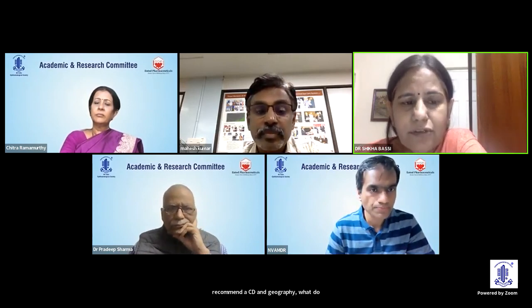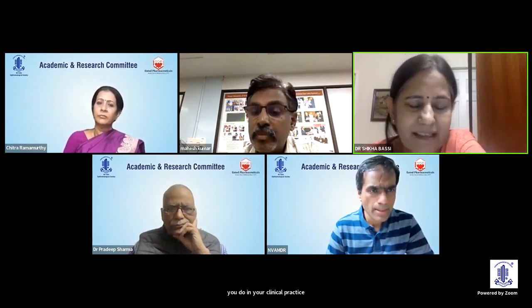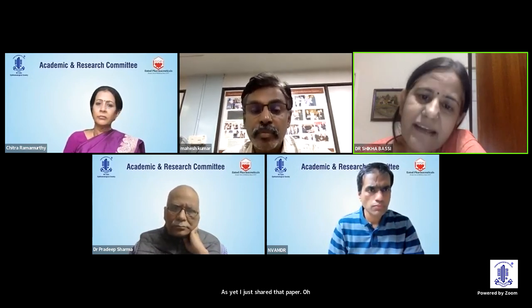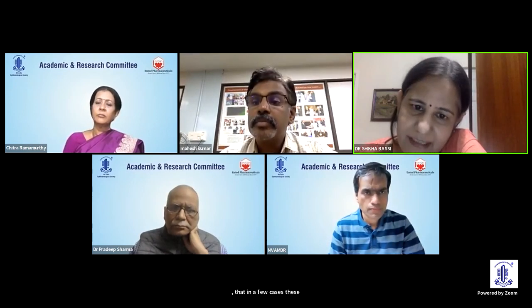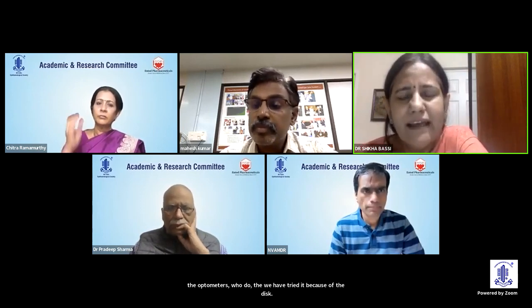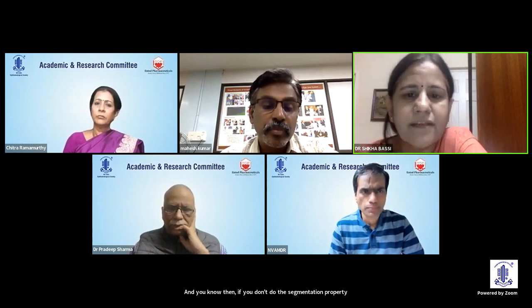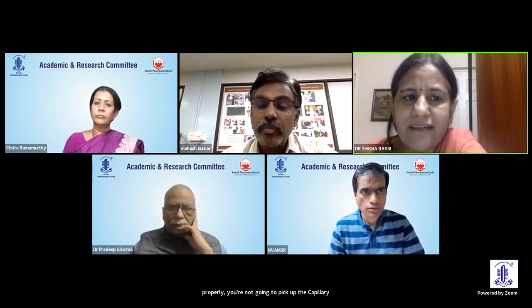Yeah, that's what, Murli, I've just shared the paper. I have OCT angiography in my clinical practice. I'm not using it for ischemic optic neuropathy as yet. I've just shared that paper, for this very reason, that in acute cases, the segmentation becomes very difficult. The optometrists, we've tried it because of the disc edema. Even if they manually try to do the segmentation, it's very difficult to do it. And then if you don't do the segmentation properly, you're not going to pick up the capillary dropout area. So it needs to be done.